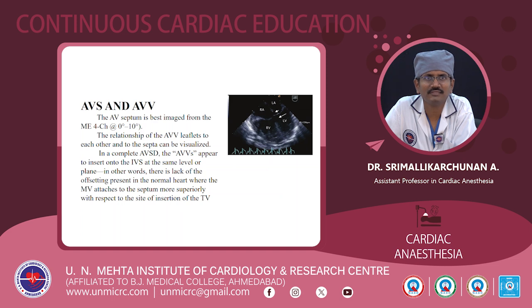In other words, there is lack of the offsetting present in the normal heart, where the mitral valve attaches to the septum more superiorly with respect to the site of insertion of the tricuspid valve. This is a TE image showing the atrioventricular septal defect.